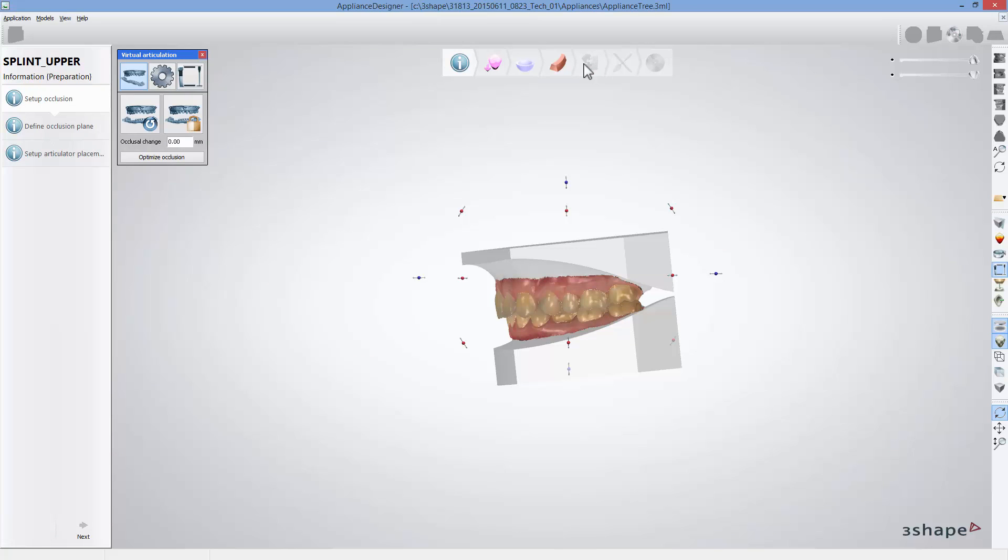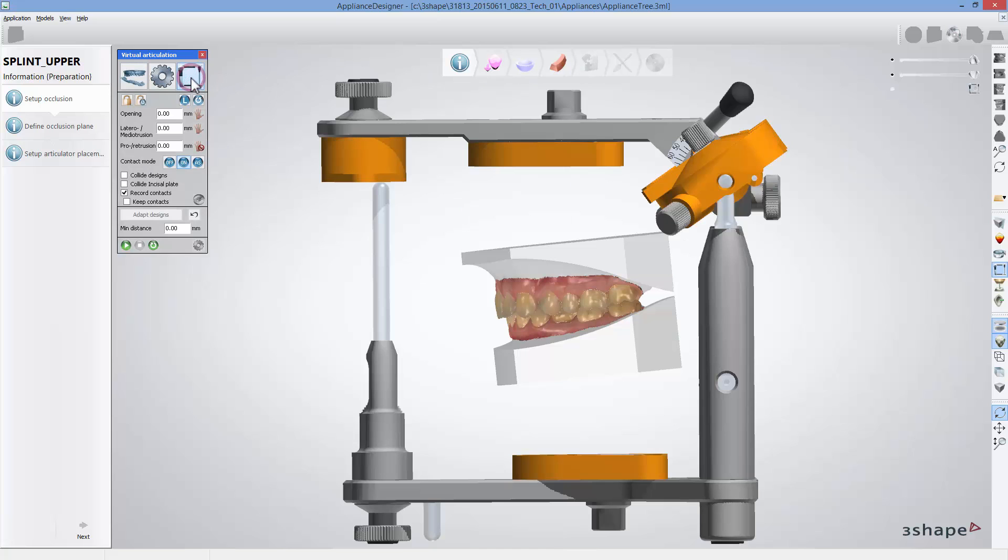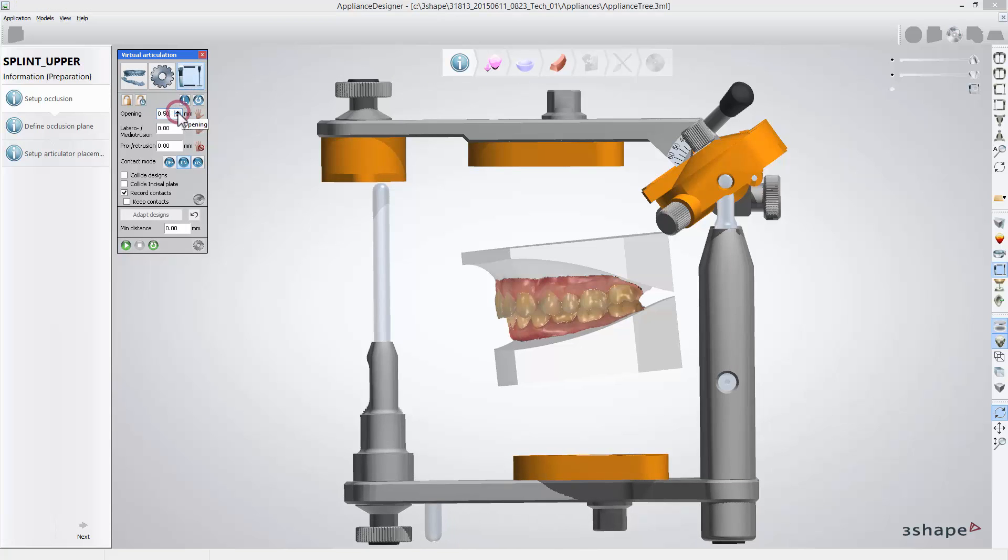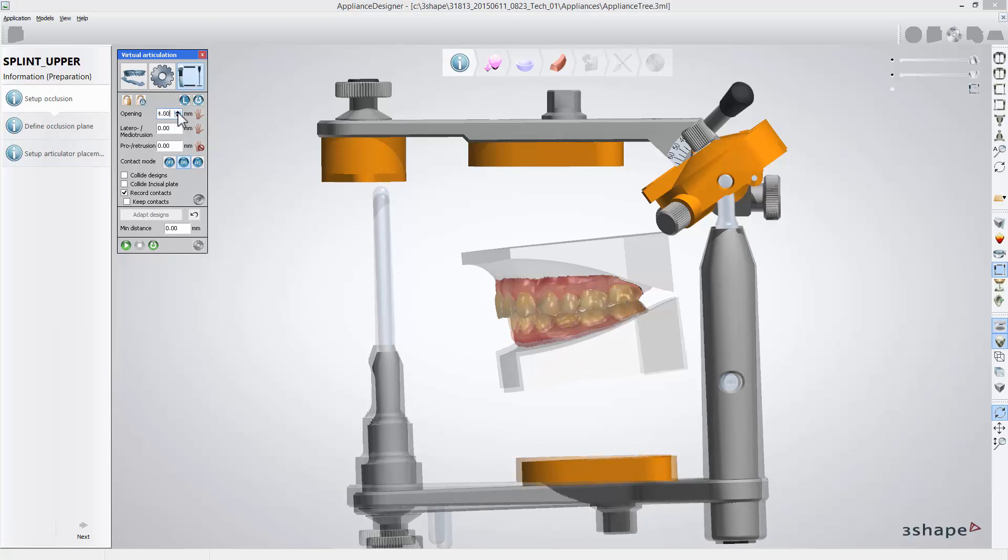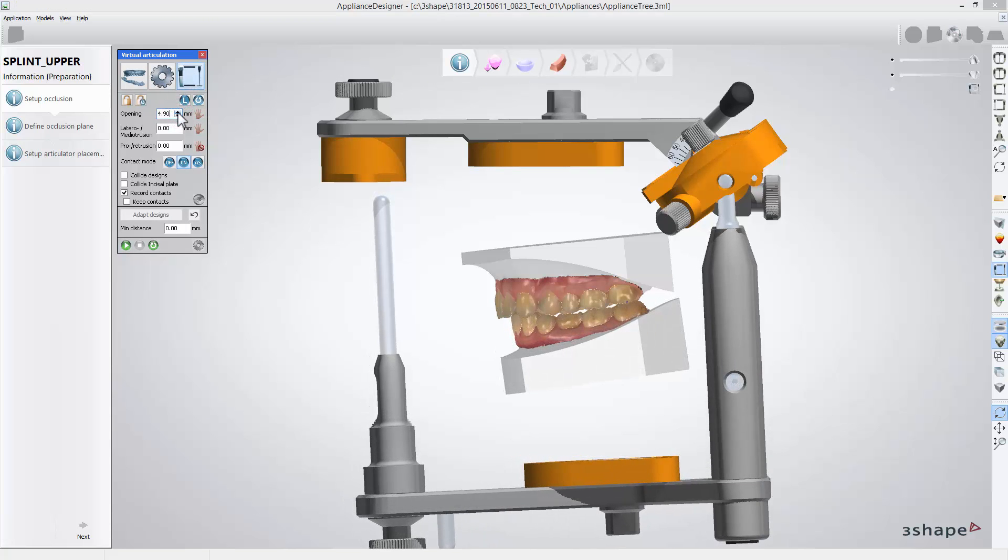Scans or models should be in correct occlusion. If occlusion requires adjustment, for example of opening, that can be done using dynamic virtual articulator. For that, click the articulator icon and set the opening value on the front pin.